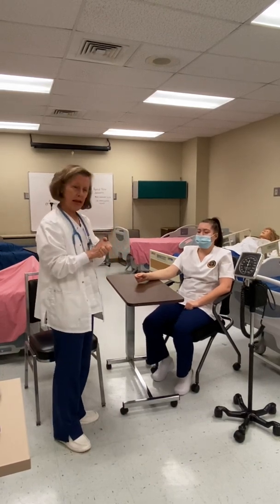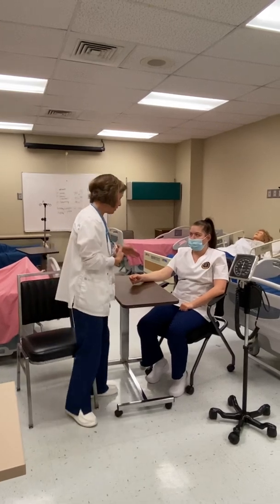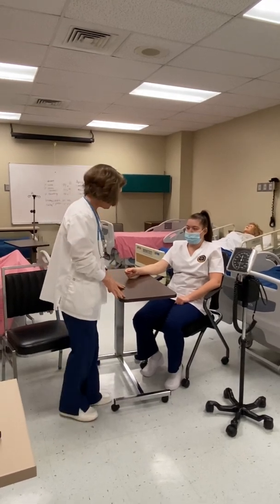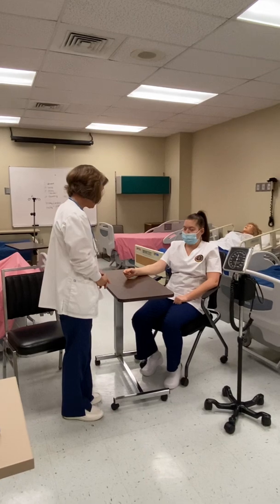I'm going to come in, wash my hands, and identify my patient. Depending on where she is, she may or may not have a bracelet, so I would ask her name and date of birth. I'll introduce myself: 'Victoria, my name is Beth Clauber and I'm going to be taking your blood pressure this morning. Is that okay?'